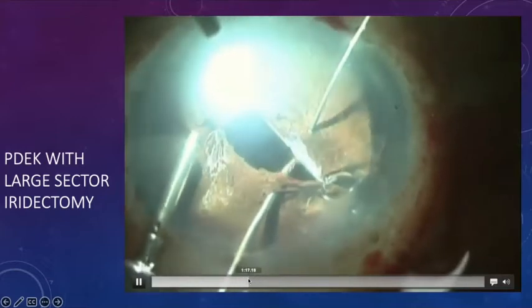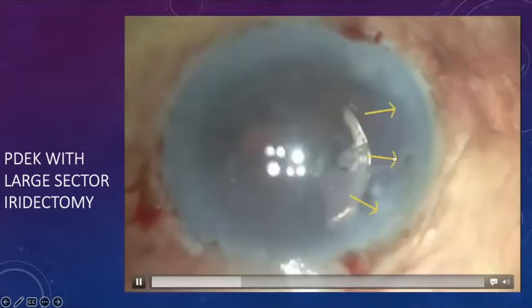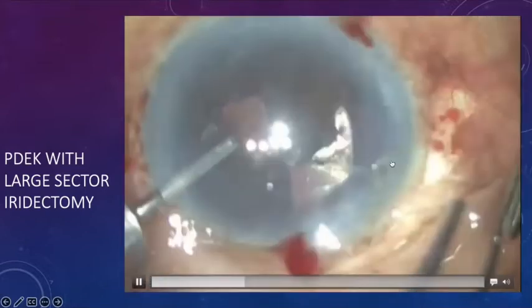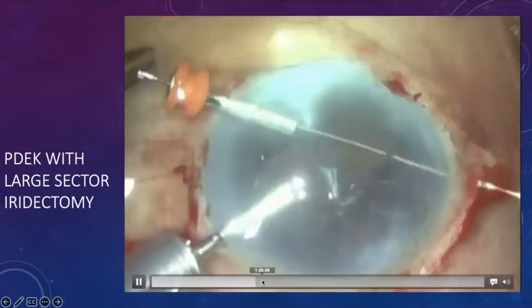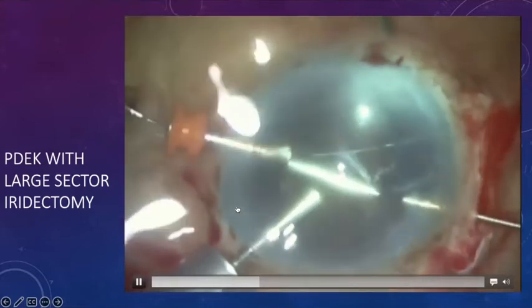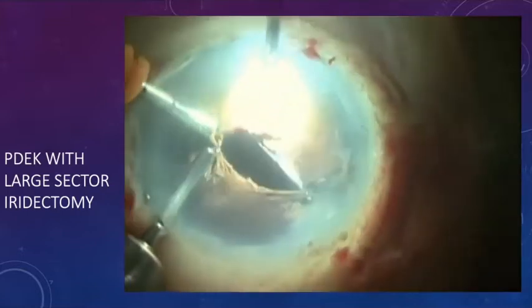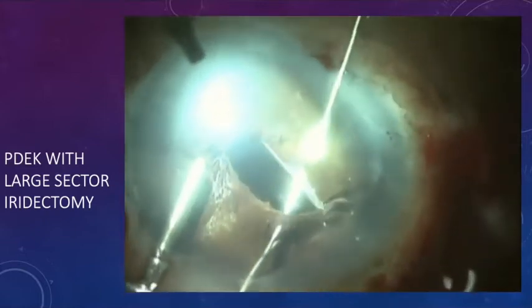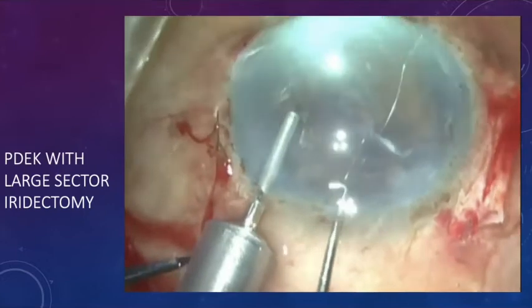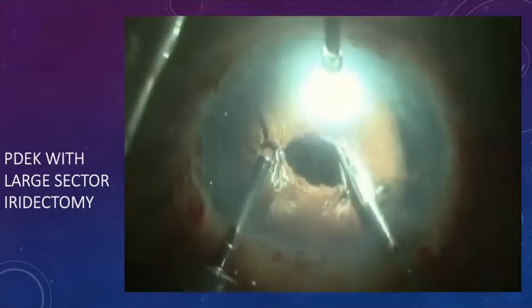And now we've made the pupil smaller in this aspect, but we also have this large iris defect here. My plan is to do an iridodialysis repair kind of procedure for this missing large sector iris defect. So what I do is create a groove, get fluid flowing through the anterior chamber maintainer this time, and use a trocar to prevent the needles from engaging on the corneal lip, as Dr. Amar had found that this was a very easy procedure and prevents accidental capture of the corneal lip with the needle that's being used for iridodialysis repair.